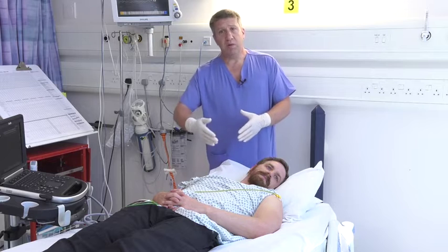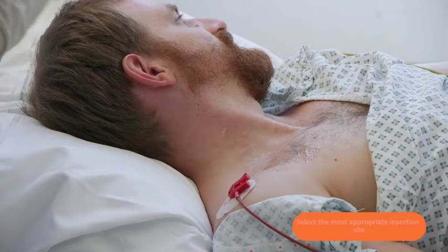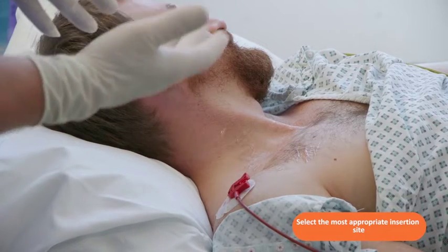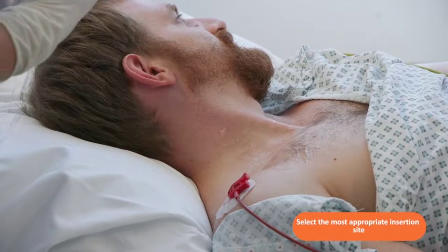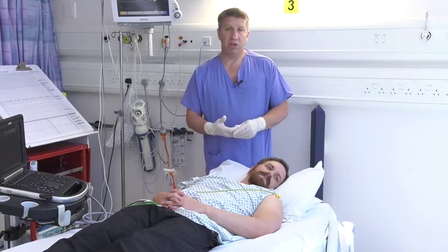The last thing we want to do once we've selected our vein is select the most appropriate insertion site. This is related to aftercare. It may be related to whether the patient has a beard or any other anatomical features that may suggest to you that you want to use one particular approach rather than another.